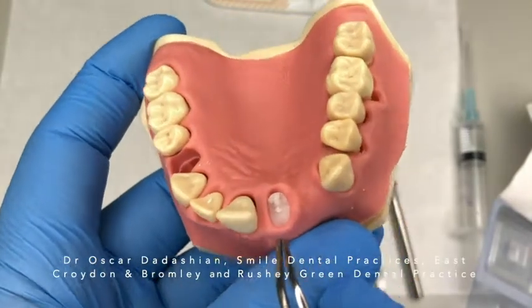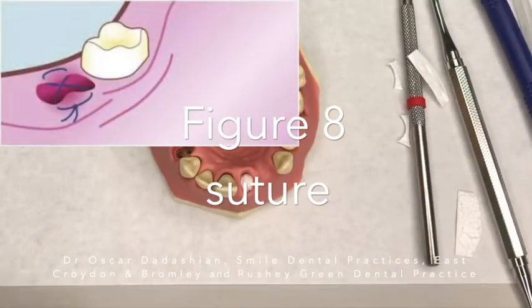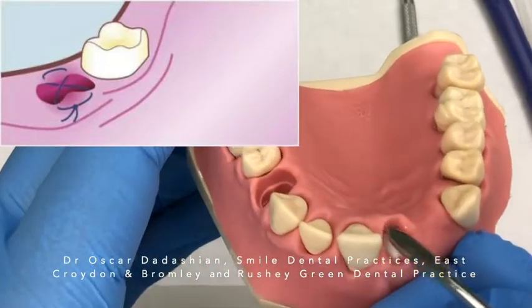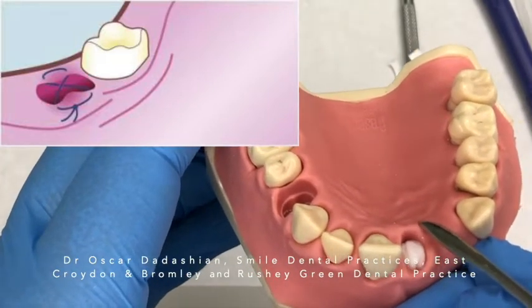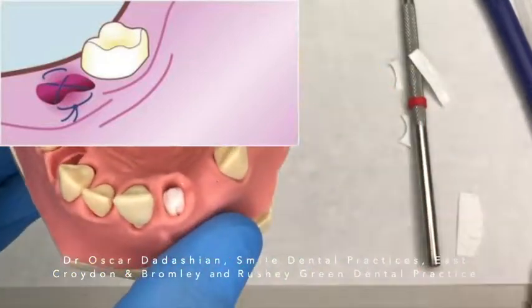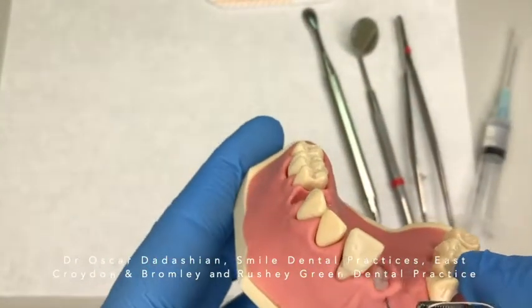To place a figure-of-eight suture, I basically go from one end, cross over to the other end, then go to the other side and cross over again, and make a knot at the buccal surface. You don't need to place any other collagen membrane on top of this — it can be left exposed.